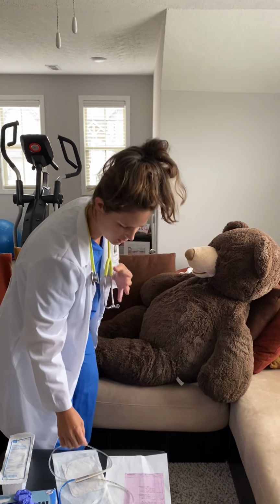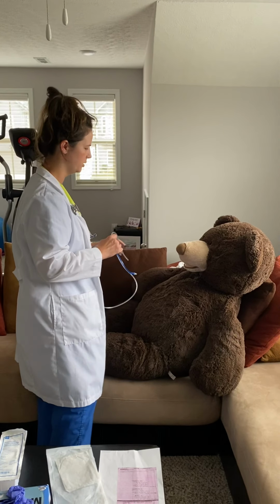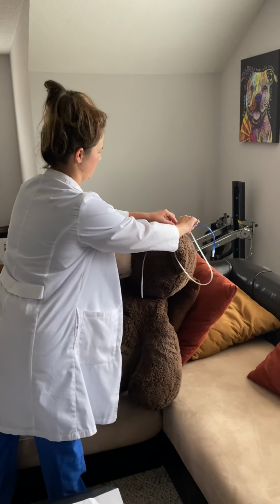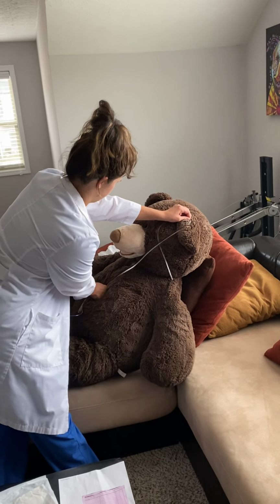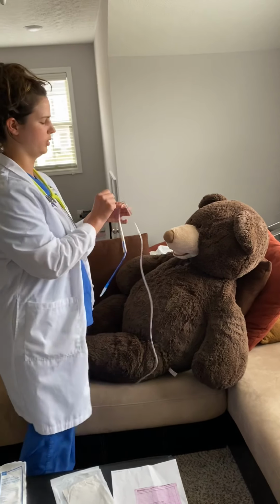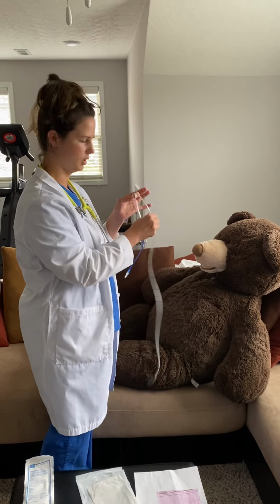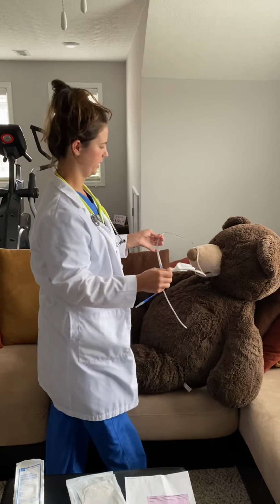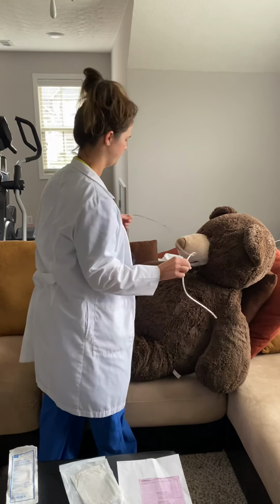And you want to first measure, and you want to take the tip of the tube and measure from the tip of the nose to the tip of the ear, then down from the tip of the ear down to the sternum, the xiphoid process here. And you want to take your pen or tape and mark right there, because that's where you're going to end your tube feeding. And it also lets the oncoming nurse or doctor know where the placement is supposed to be.